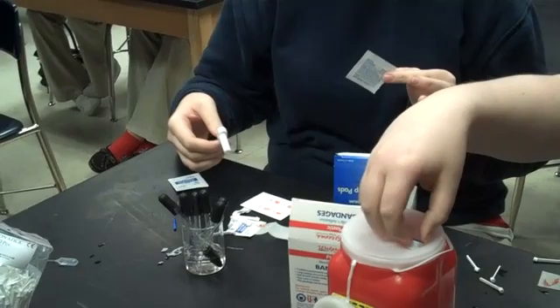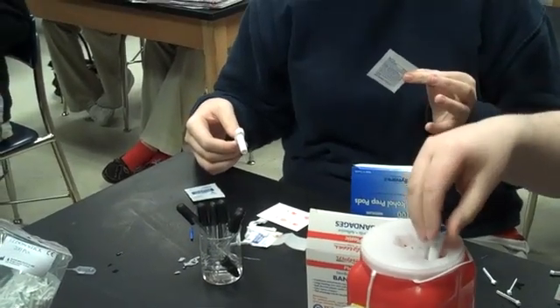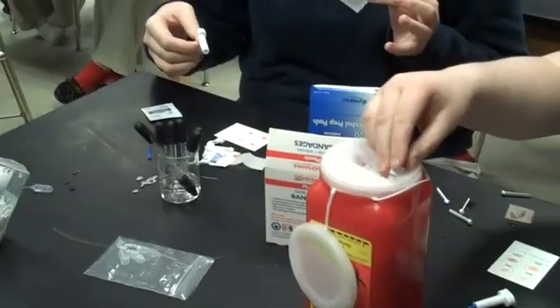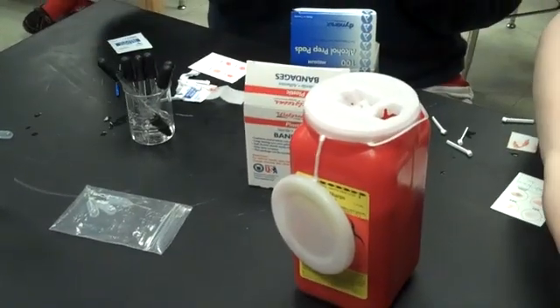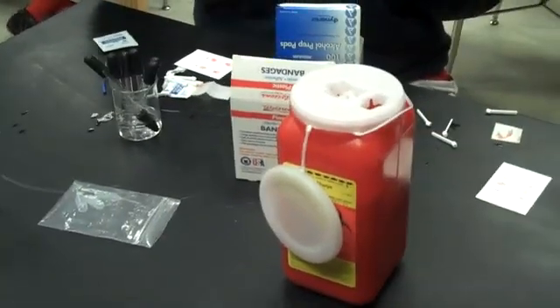They don't fit. Way to get lancets that don't fit in my container. Push — there we go. We can put the sticks in there too.